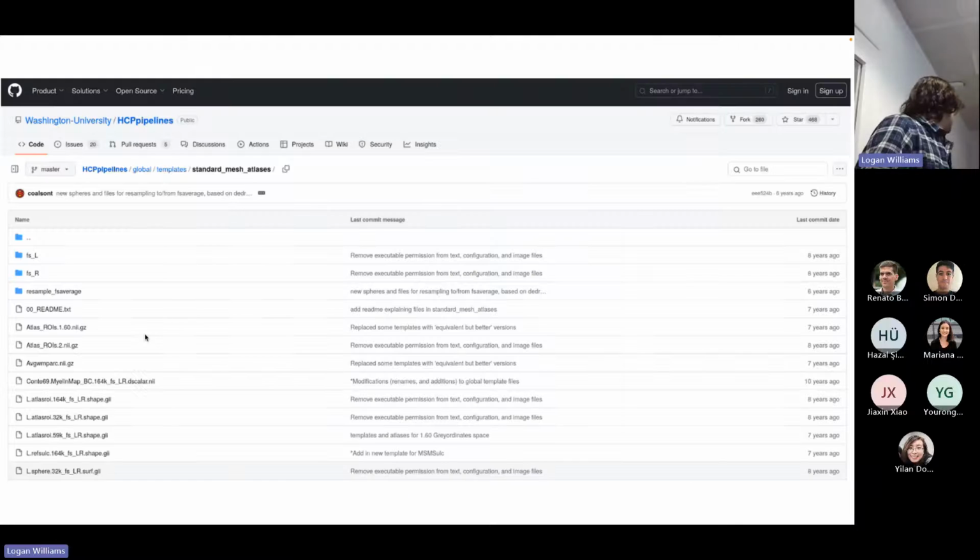For babies, all the baby templates are on the biomedia website, braindevelopment.org. Yes, it's brain-development, there's a dash. If you search for biomedia brain-development.org, then it will come up. I never remember.